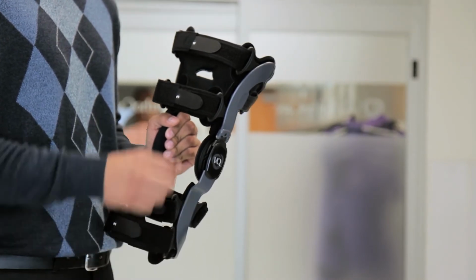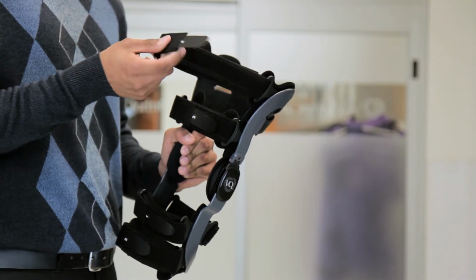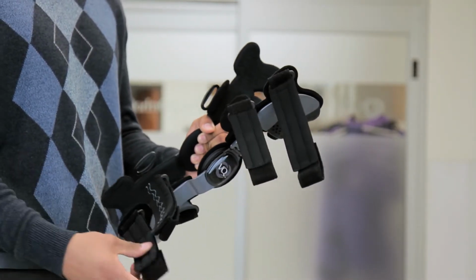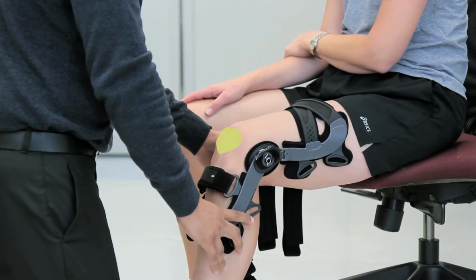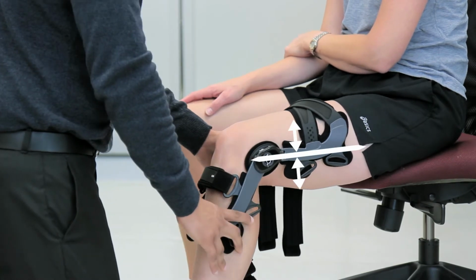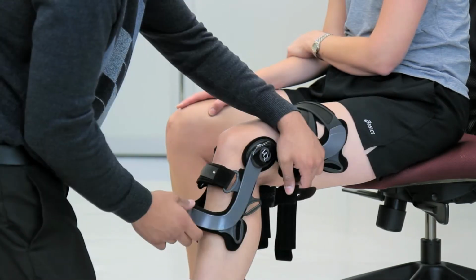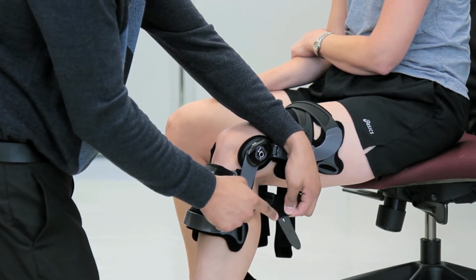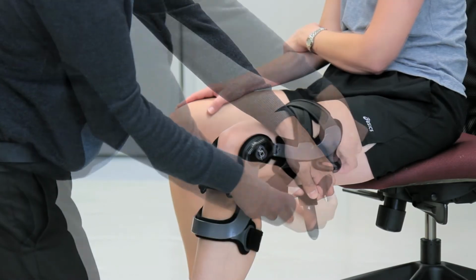Undo the 4 straps behind the leg and fold the straps down so that they don't get tangled. Place the brace on the leg so that the top of the patella is lined up with the middle of the hinge, indicated by the gray extension stop. Press the brace down so that the side of the frame sits mid-medial and mid-lateral on the leg or slightly posterior. Tighten the straps according to the sequence on the numbered strap tips, starting with the upper calf strap and ending with the upper thigh strap.